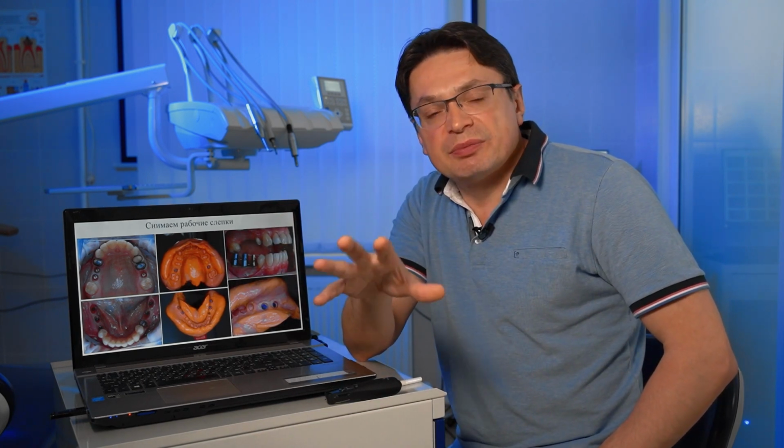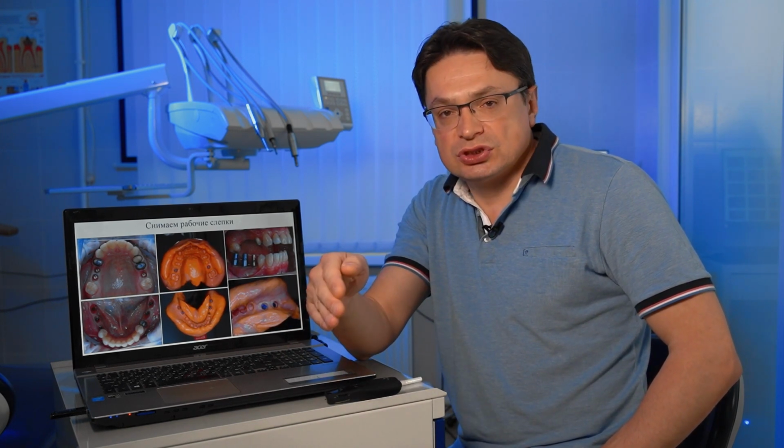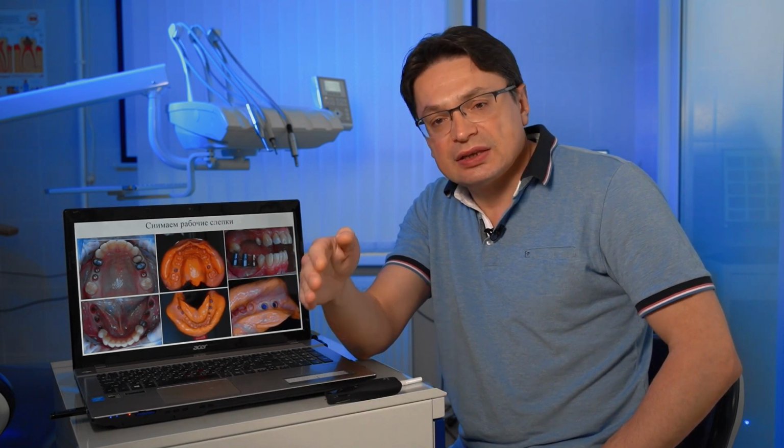Have installed temporary prosthetics. It is not just for aesthetics, this is also treatment. Next, we assess the patient's condition, and only after that you can take the next step, a step towards permanent prosthetics, and then you probably won't get problems.